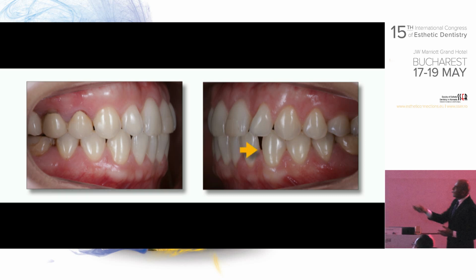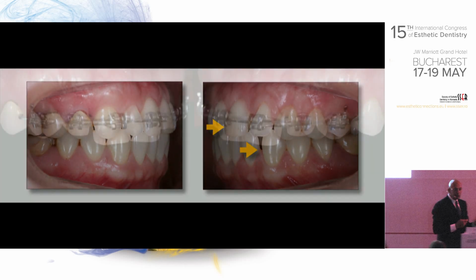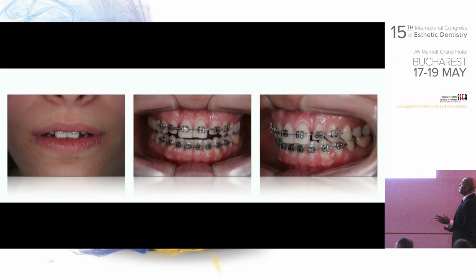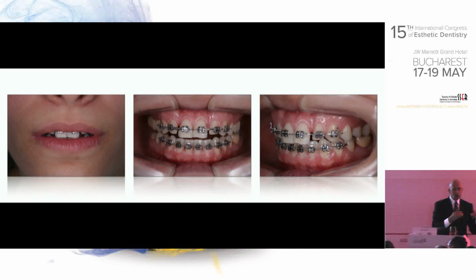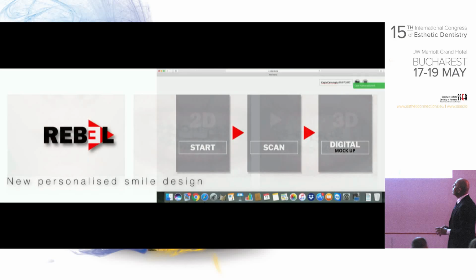And in this case, the aim is to bring the lower incisors inside and upright the upper teeth and close the space between the central, lateral, and the canine as much as possible. I don't want it to be 100% because I'll treat the patient with veneers after all. So this is almost towards the end of ortho. Nuno did a great job bringing the midline into position, bringing the incisal edges to a reasonable place.